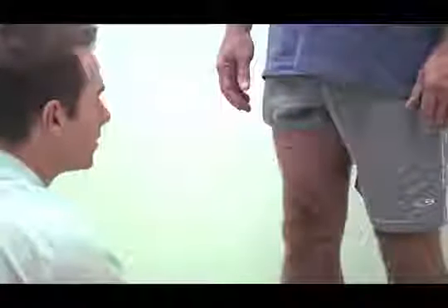Step 3 is taking your circumference measurements at your 3 and 6 inches above and below your knee axis line. In centimeters, start at 6 inches above and take your measurement. Then at your 3 inches above, take your measurement. Then at your 3 inches below, take your measurement. And then at your 6 inches below.